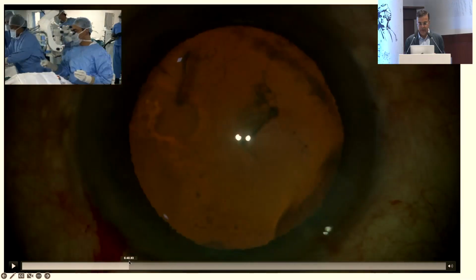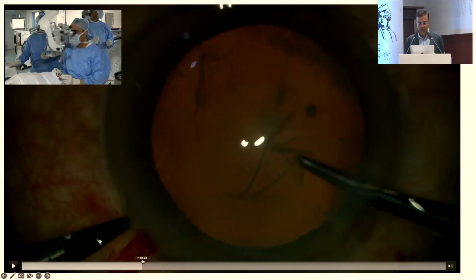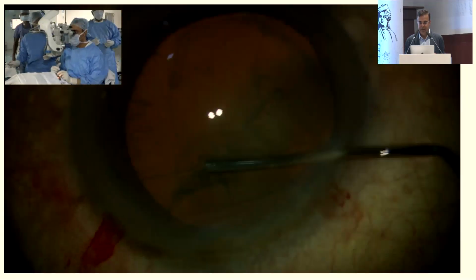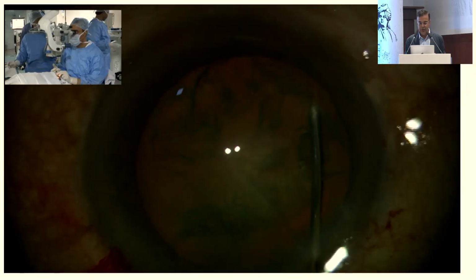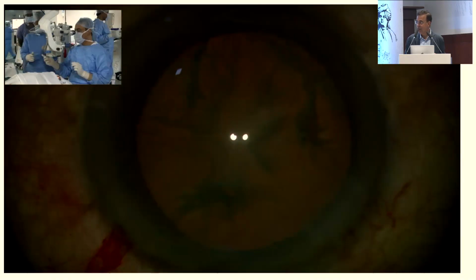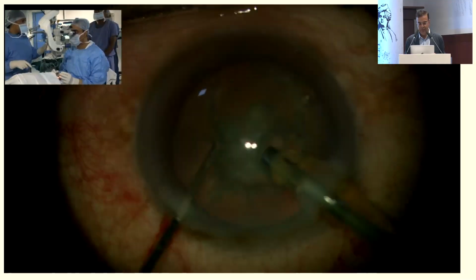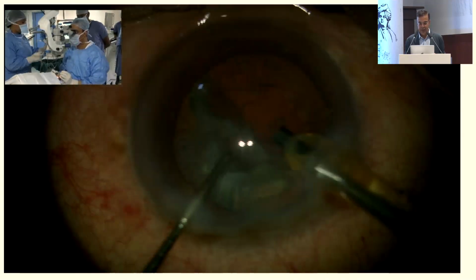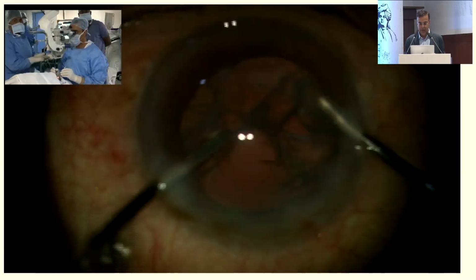When nothing else works, I thought I'd go around it, but eventually what we did was let that small break be alone. We made a rhexis as usual and just ignored that small puncture in the periphery. Because I was not using any forces in that area, at the end of surgery I was able to actually do everything right.